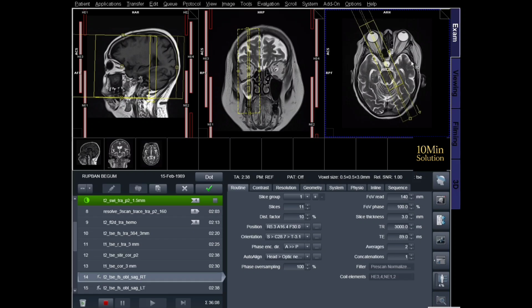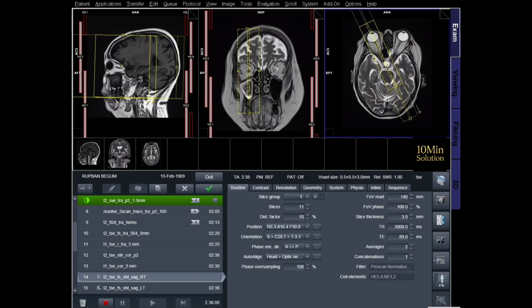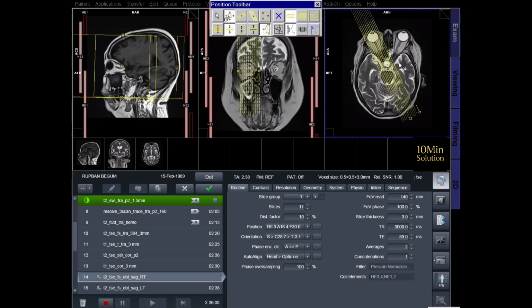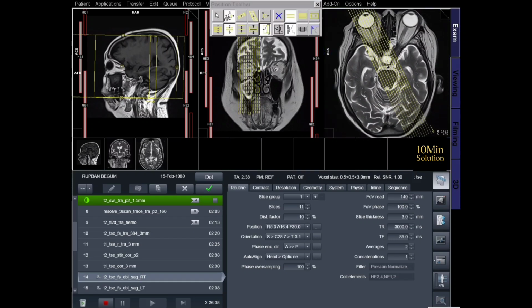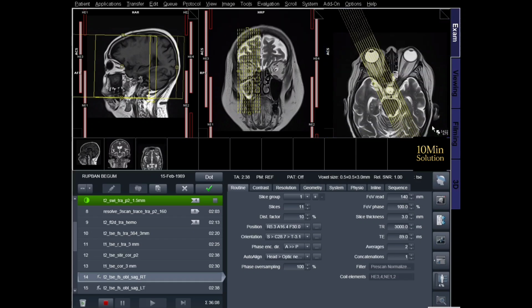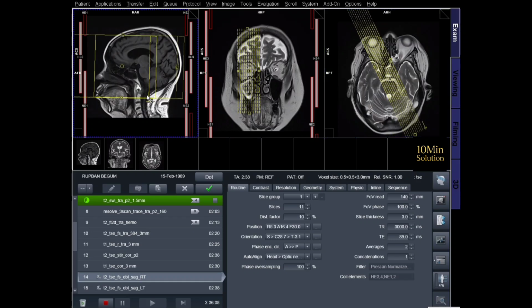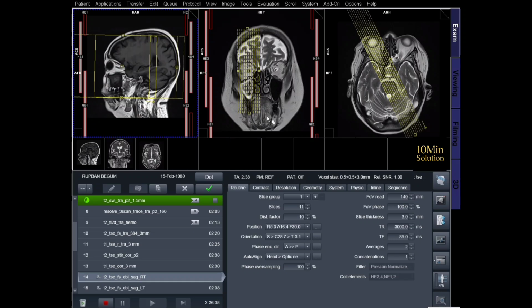Imaging planes and planning. MRI of orbit is typically performed in three main imaging planes. Axial plane. The axial plane is usually planned parallel to the infraorbital meatal line or along the optic nerve axis. This plane is useful for visualizing the optic nerve, extraocular muscles, and orbital apex.